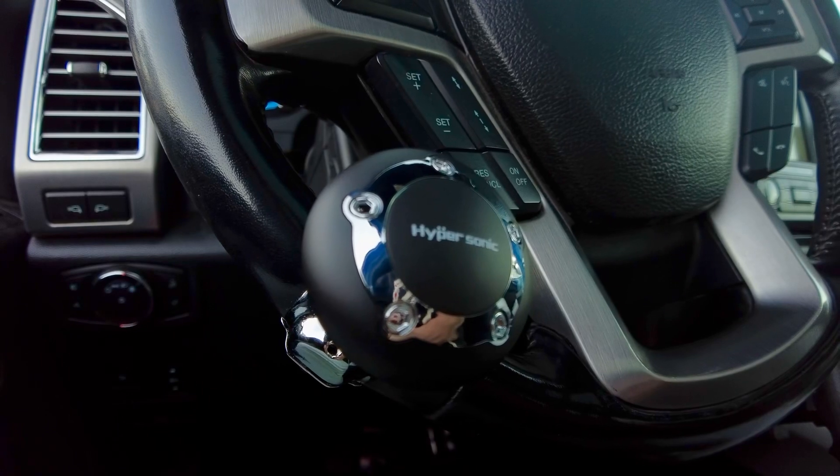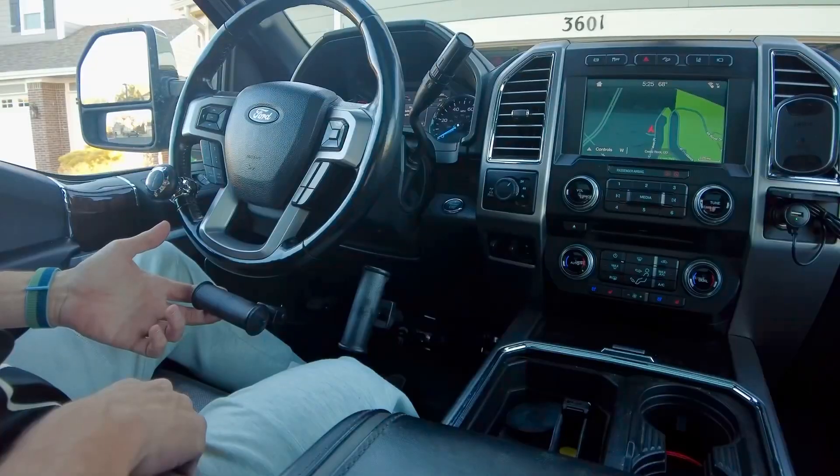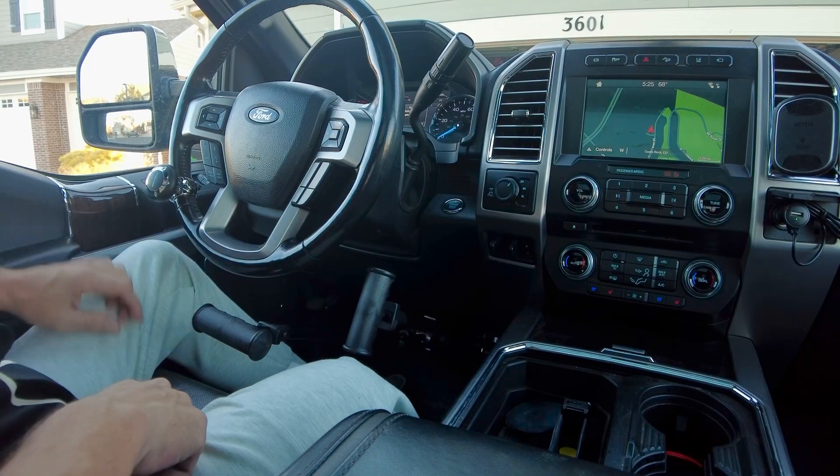Today I received my first set of portable hand controls for my Ford Super Duty diesel — these are called the Pedal Master, from a company right here in Colorado. A family member was able to go up there and pick them up today. I've also installed a steering ball on the wheel, since I'm not quite sure what it's going to be like using hand controls, and I tow a lot of trailers and back up in tight spots. It's a pretty simple system overall — there are two pieces, one that attaches to the brake and one that attaches to the gas.